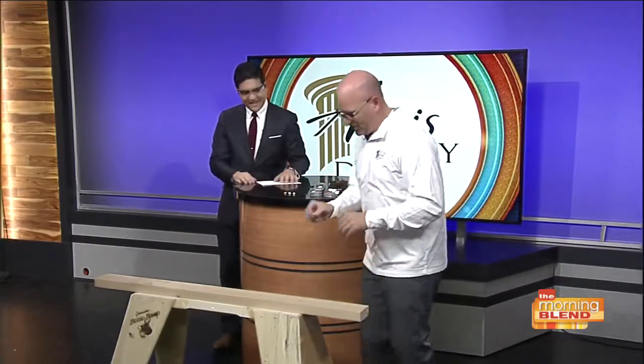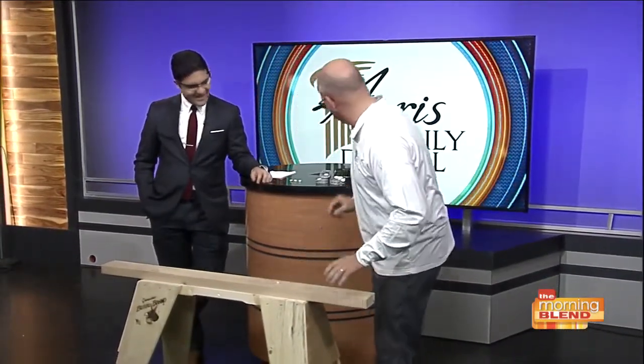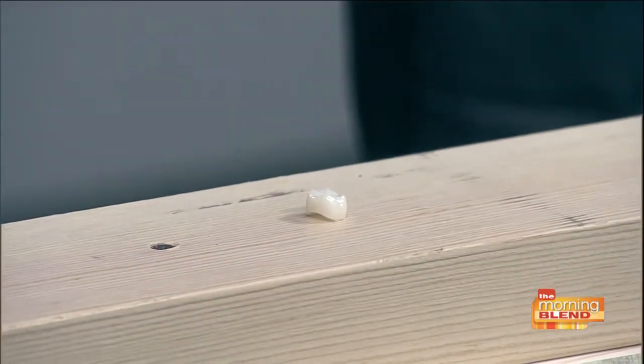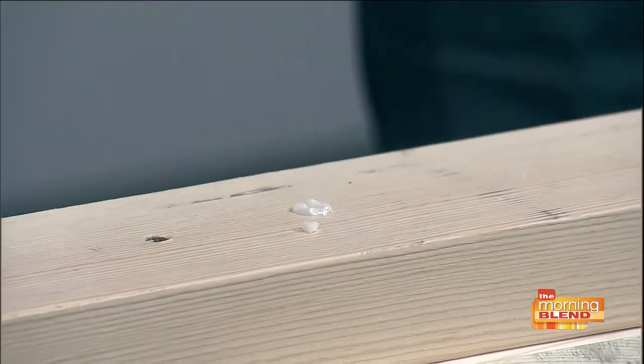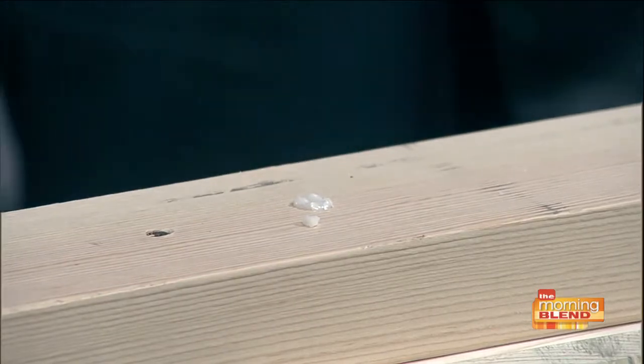So this actually does really, really well. It takes a couple of hits and then it'll break, but why don't you hold that in for me, Alex? Okay, I'll ride the horse. Ready? All right, here we go. Whoa. So that one, okay. One hit. That one's chipped. That's the lithium disilicate. Okay.